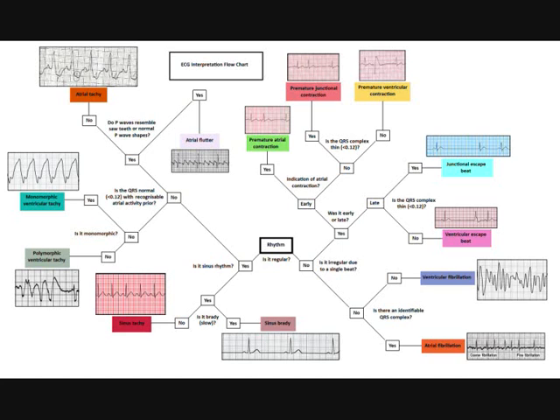Is it regular? Yes. Is it a sinus rhythm? No. So we move on to: is the QRS normal, and is there any recognizable atrial activity prior to any of those QRS complexes? What we're trying to determine is: is there atrial activity and are the ventricles contracting normally? If the ventricles are not contracting normally within that 0.12 seconds and you can't see any recognizable atrial activity, we can safely start to think that it might be ventricular tachycardia.